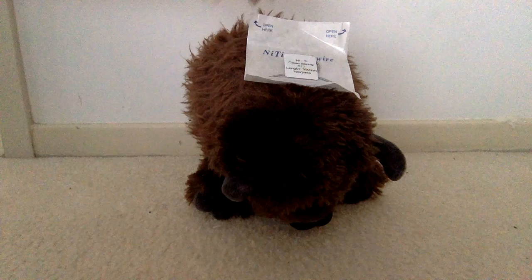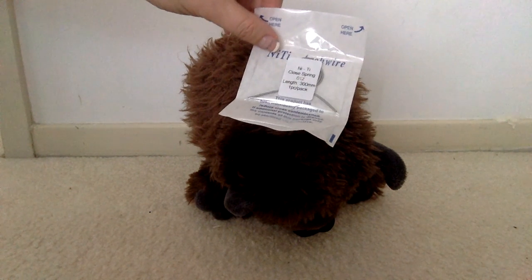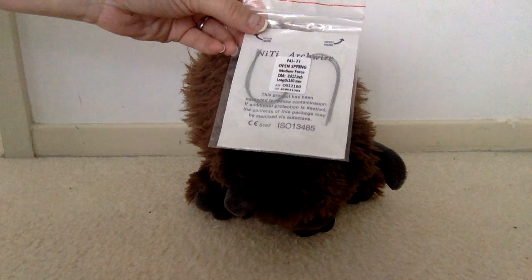So here we have my buffalo friend, but we also have a closed coil NiTi spring. This is 012 gauge — there are a couple of different gauges, and this is one of my favorites. And then we also have an open coil NiTi spring, medium force, 012 gauge.